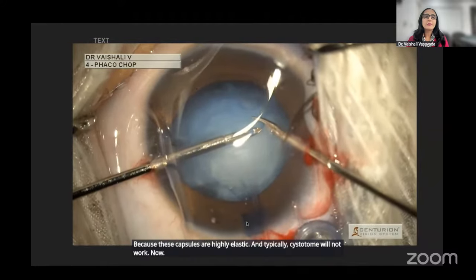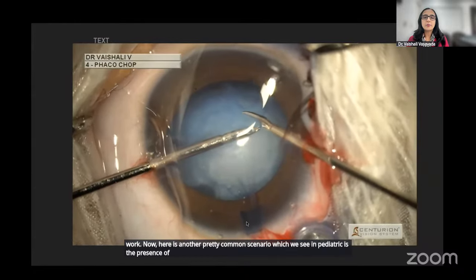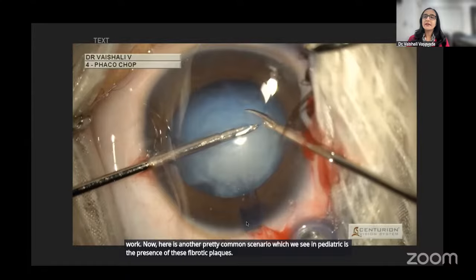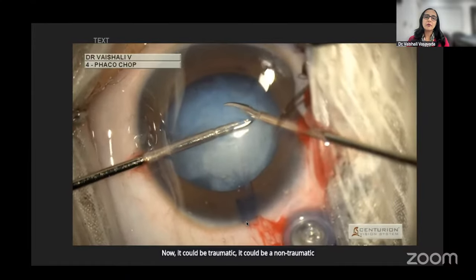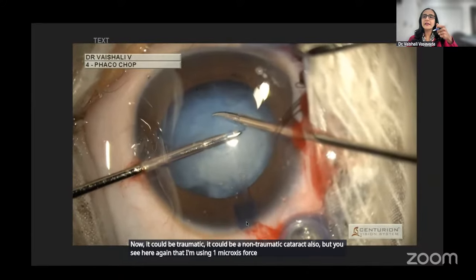Now here is another pretty common scenario which we see in pediatric cases, the presence of these fibrotic plaques. Now it could be traumatic, it could be a non-traumatic cataract also. But you see here again that I'm using one microrexis forceps to hold and give traction.